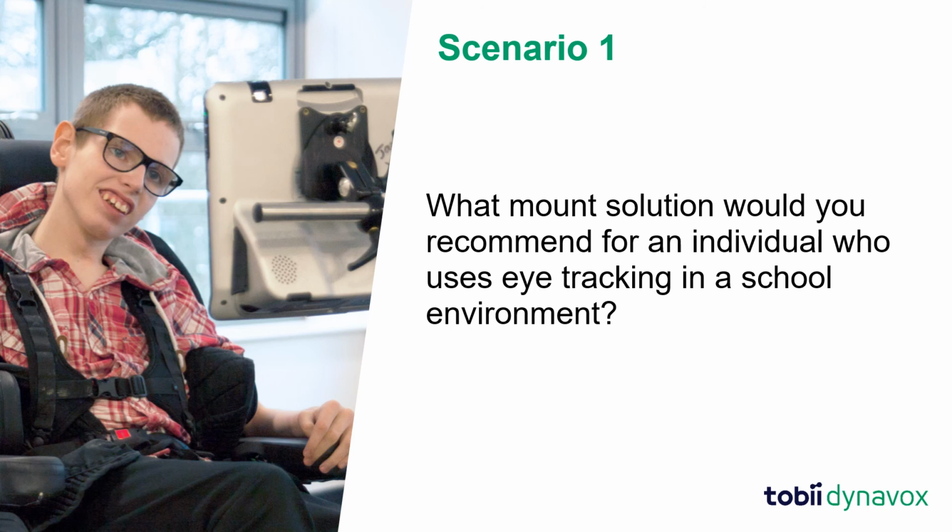If this is a trial for an AAC device, it is easier to set up and use a floor mount temporarily. While a wheelchair mount may be requested, a floor mount for temporary use in a device trial will be a more flexible option for positioning and evaluation.